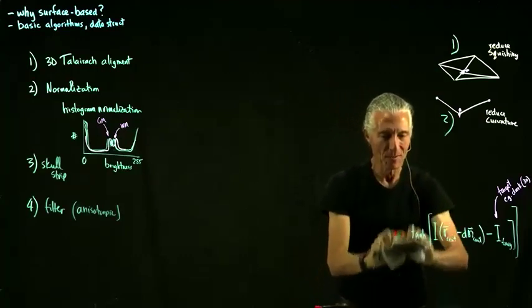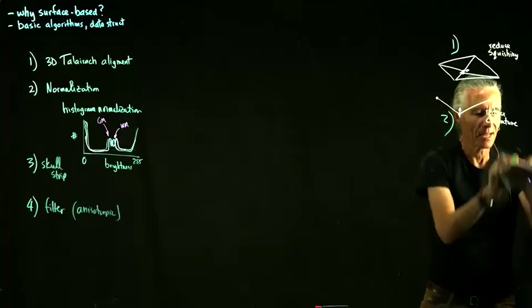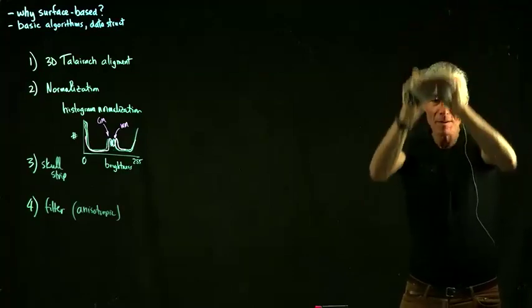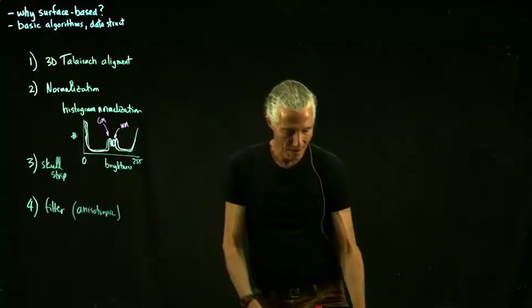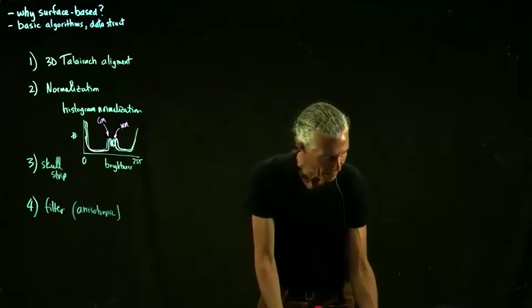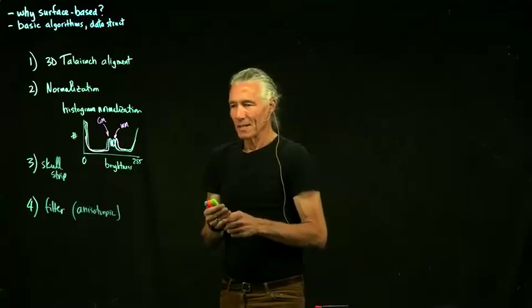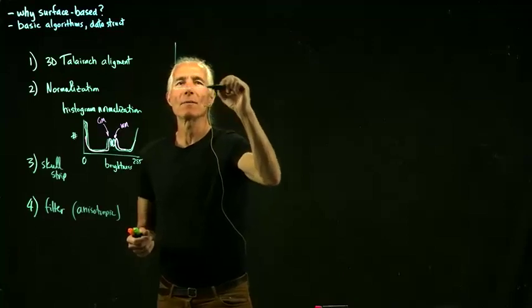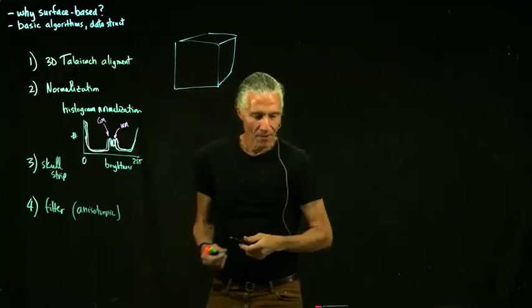And so one of the things you find out if you try to write algorithms like this is that you really have to be extremely accurate in your segmentation of the images. And so what kind of things can you do to help with that? One thing is to do an anisotropic filter. And so what are we trying to fix?